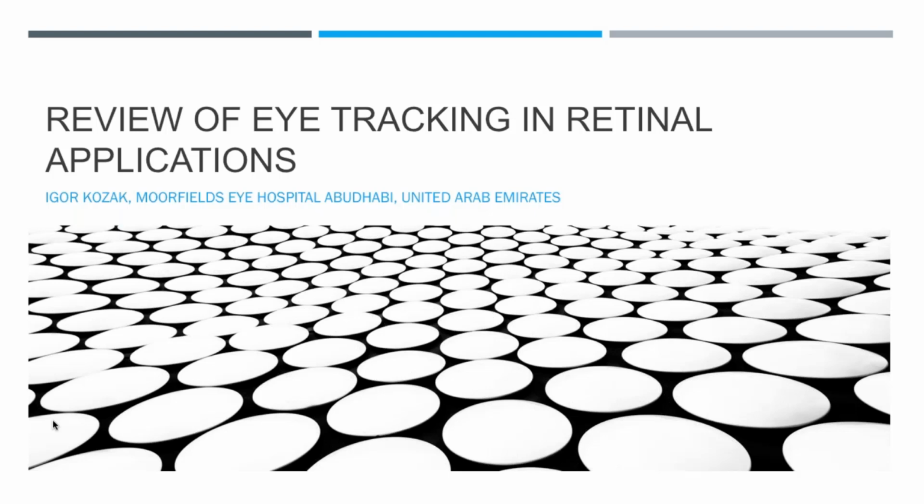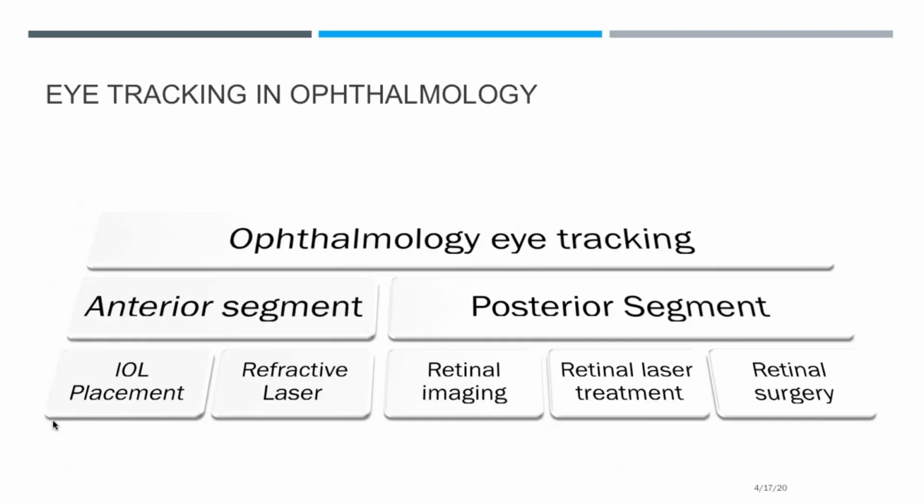Navigation technology as such is a very useful and practical advancement and is present in basically everyday life, such as transportation and deliveries, and medicine is no exception. Several medical areas are using navigation inputs in diagnostics and in surgery, such as urology, neurosurgery, ENT surgery, and ophthalmology is no exception to that. So eye tracking or navigation in ophthalmology covers all anatomy of the eye and covers both anterior and posterior segment.